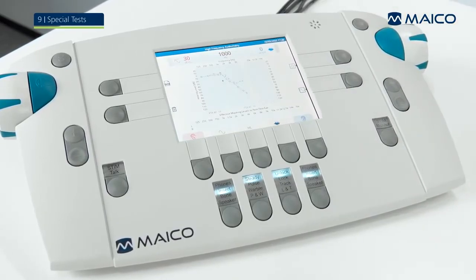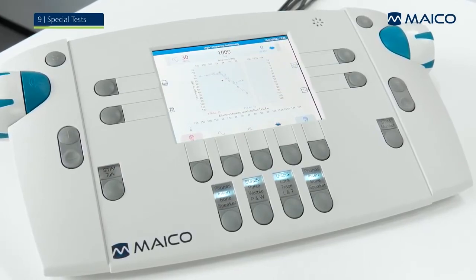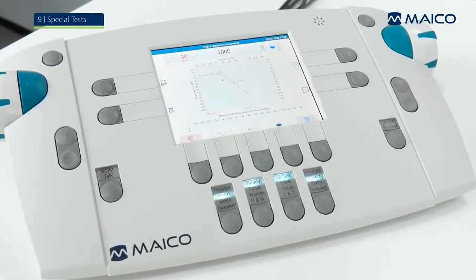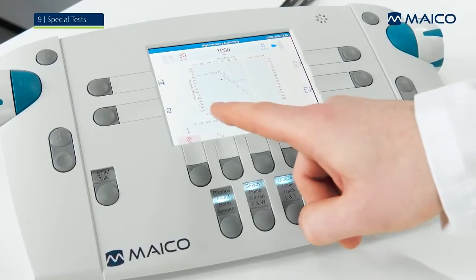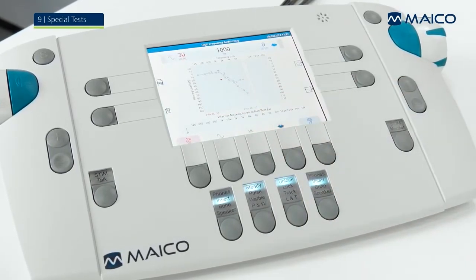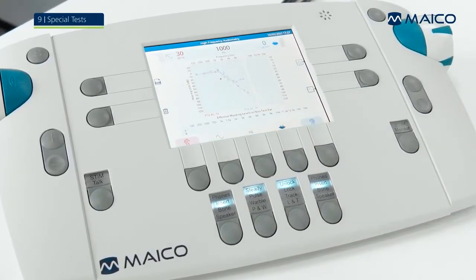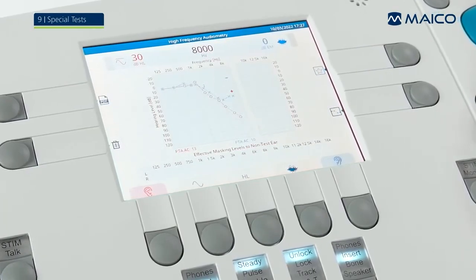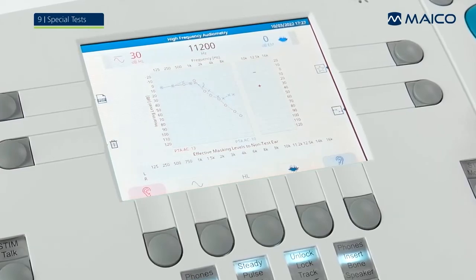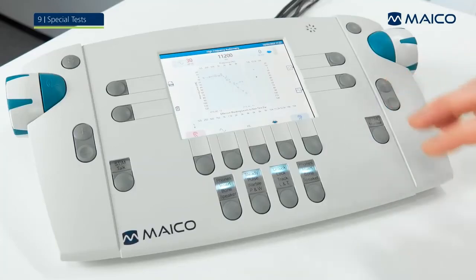The layout and operation of the high-frequency audiometry is similar to the pure-tone audiometry. Additionally, the high-frequency test screen shows an expanded audiogram view. The left audiogram displays the values for the standard frequency range. The right audiogram displays the values for the high-frequency range from 9 kHz to 16 kHz. The values for the left and right ear are combined in the same audiogram and can be distinguished by color and symbols. Red is for right and blue is for left. The testing procedure is identical to the one in the pure-tone audiometry.